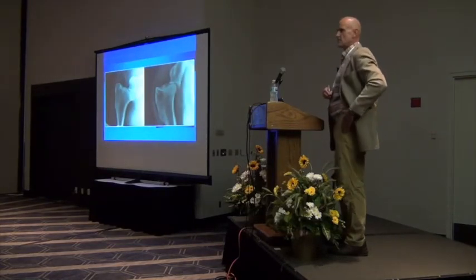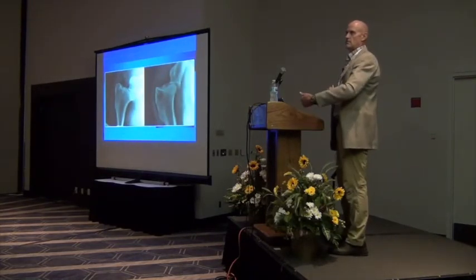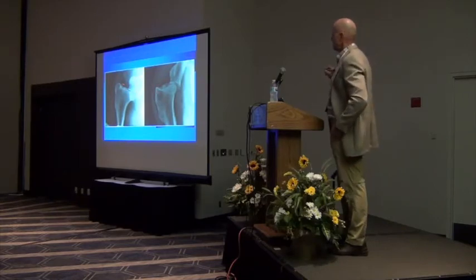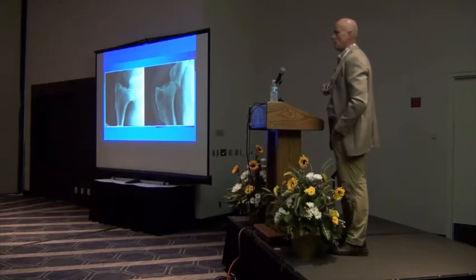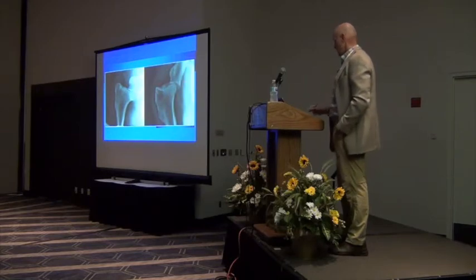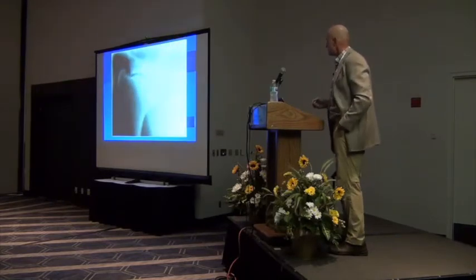Okay, and don't forget stress. Pick this leg up and move it out a little bit, and this is subluxing. You can see right there where we're pulling it forward, it's opening up, and then when we pull it out laterally and take an oblique, it's actually coming out of the joint there.